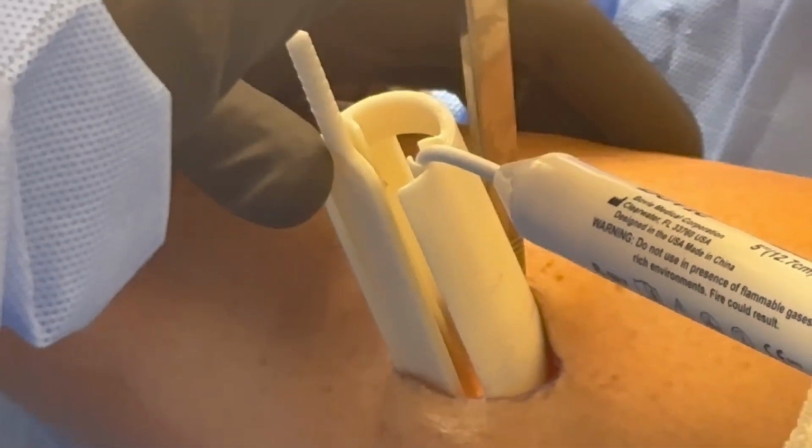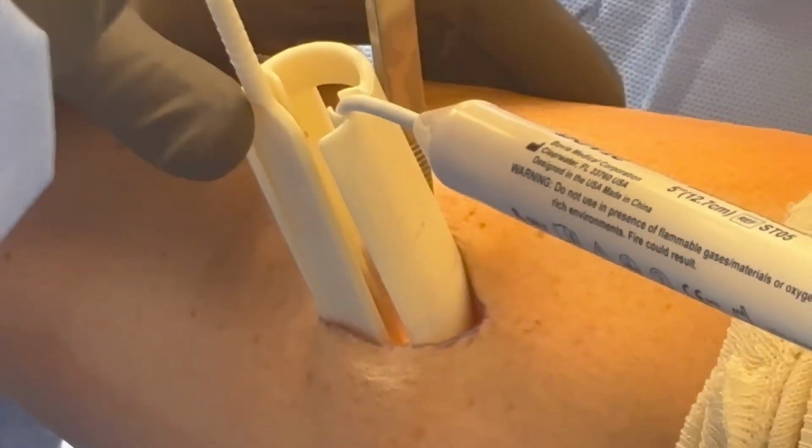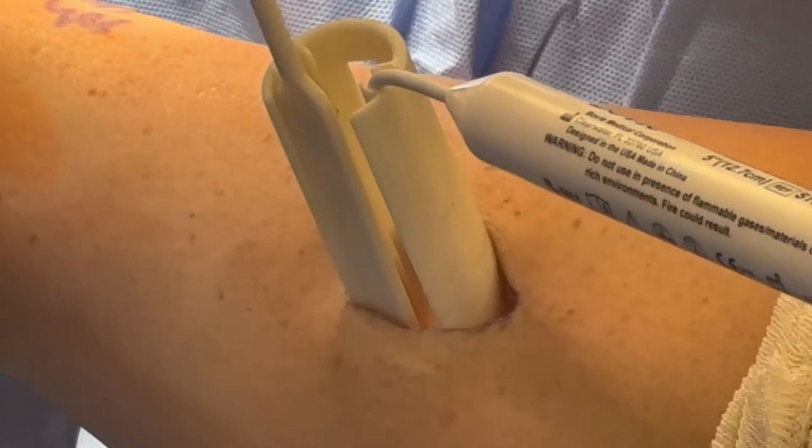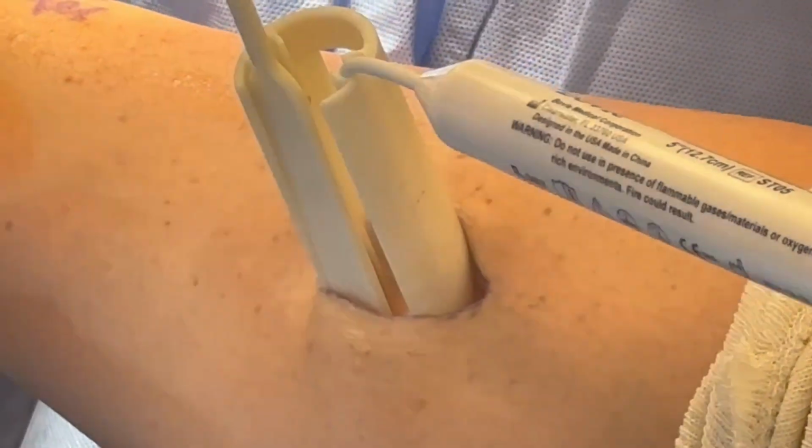And that's what I'm doing here. And you can see the angle of my blade. I'm cutting right into that backstop to protect the underlying muscle, but get a complete release all the way from lateral to medial.